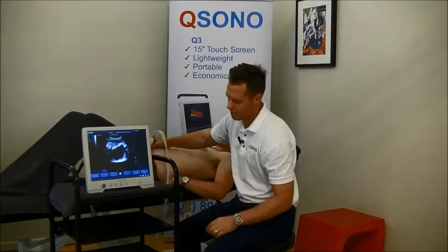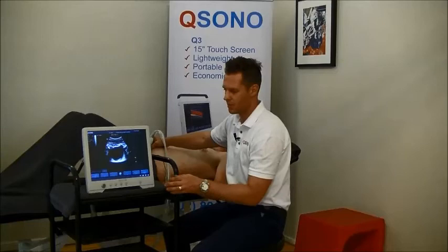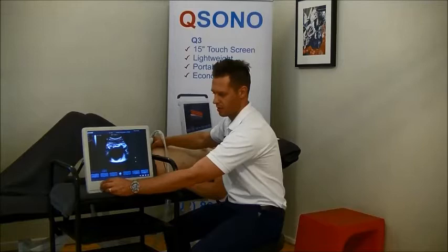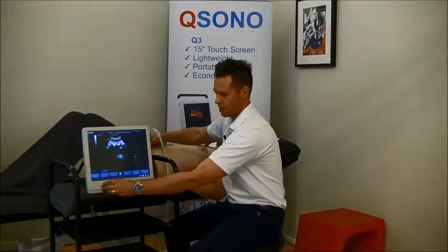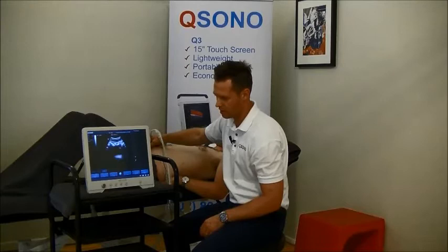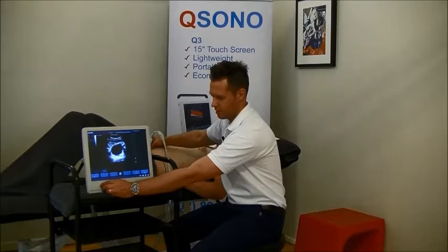The first thing that you want to do is adjust the depth of the image so that the bladder appears in the right place on the screen. And you can also see it moving. And I usually just tilt and rock the probe back and forth like this until I find that I get a nice clear image at the base of the bladder there. And I can see that we're going to be able to see if there's any movement.